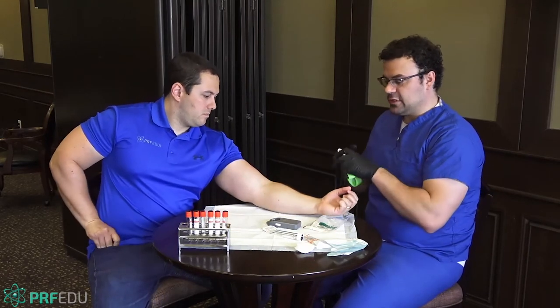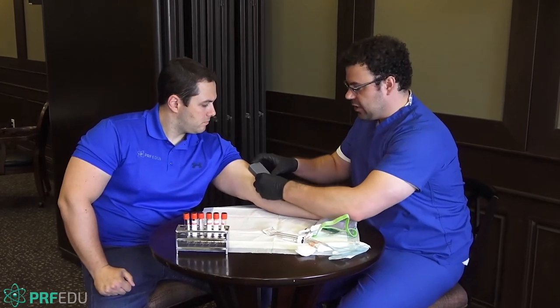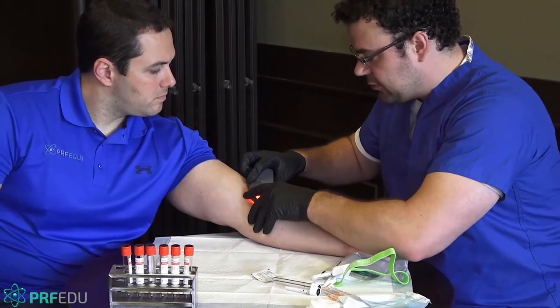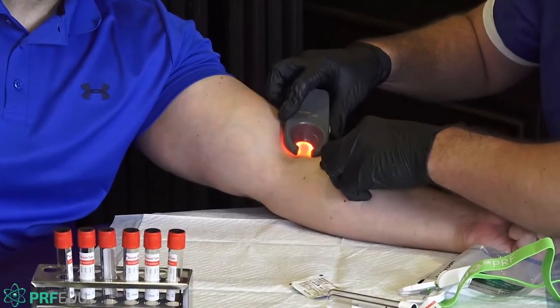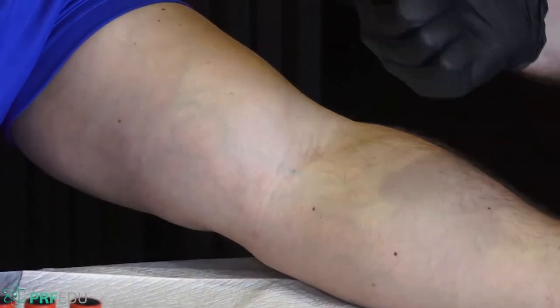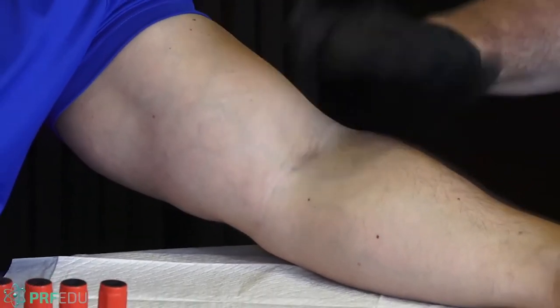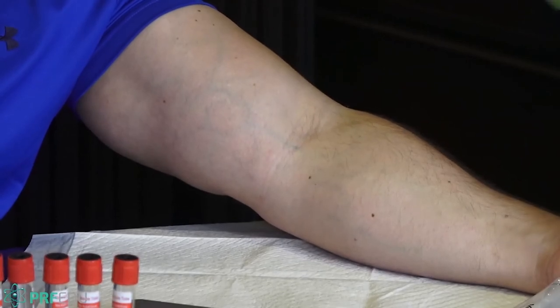So first things first, what you'll typically do is browse the arm and try to locate that vein. For Carlos, he's got a nice one that's right here. It'll be a little tricky to see from back there, but anyways, I've spotted it. Once you've spotted it, there are a few things you can do. Of course, you can ask Carlos to make some fists to try and get that vein, and you can do a little bit of tapping to desensitize slightly. In this case here, it won't be necessary.